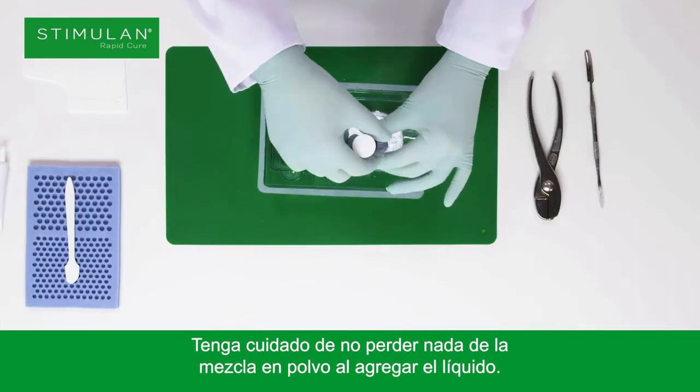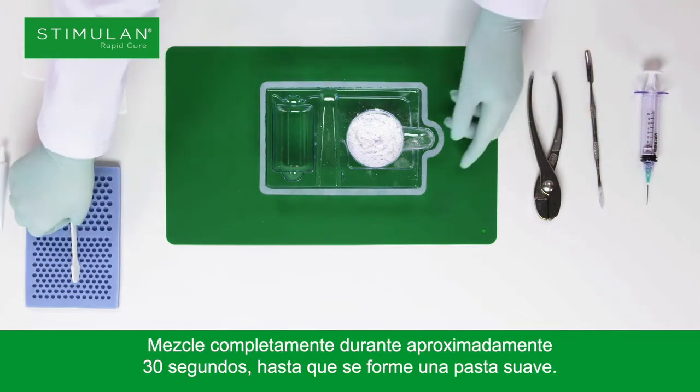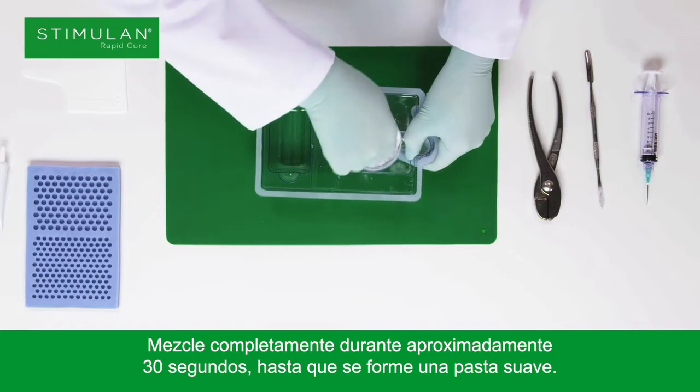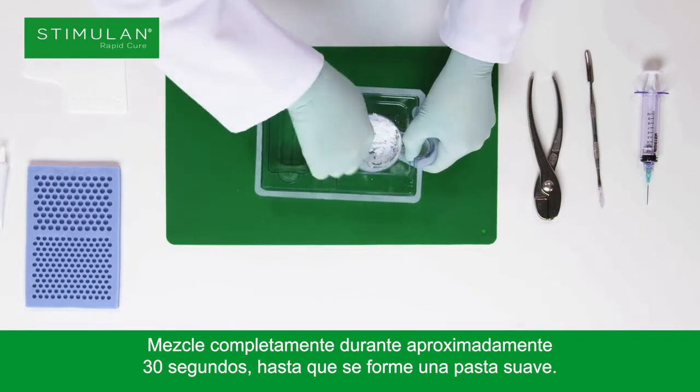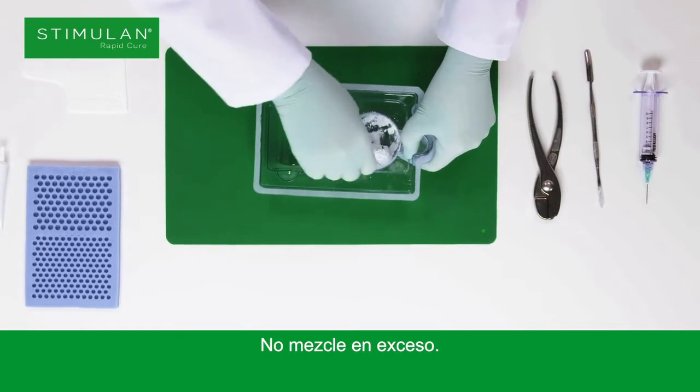Take care not to lose any of the powdered mixture when adding the liquid. Mix thoroughly for approximately 30 seconds until a smooth paste is formed. Do not over mix.